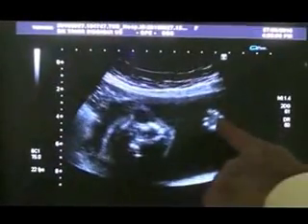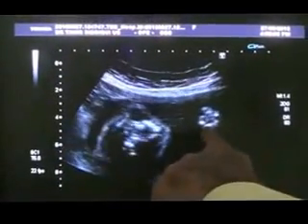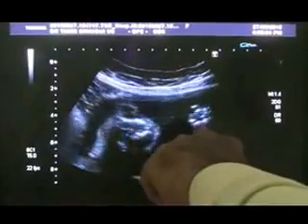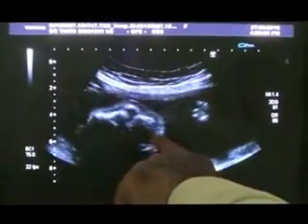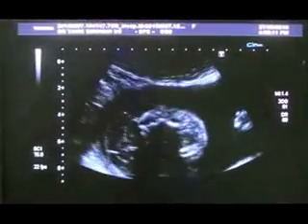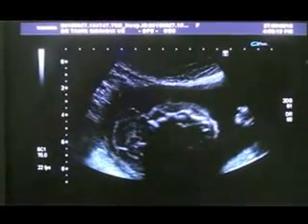There you see the hand as well. This is the hand of the fetus and the wrist, the fingers. This is the eye, this is the eye.